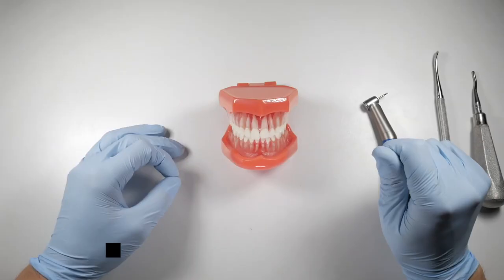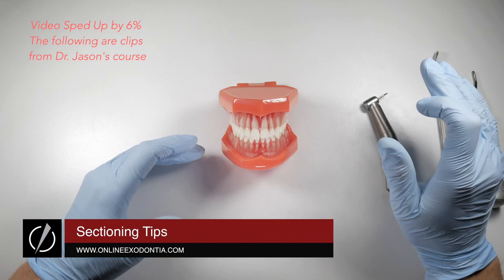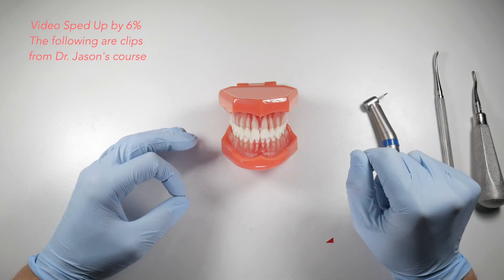In this video I'm going to share his tips on sectioning teeth and his tips on troughing bone. I hope you learn something you may not have known before. Occasionally when we're sectioning teeth and splitting them with an elevator, the crack doesn't always propagate in the direction that we want it to. That's usually our fault because we've sectioned it incorrectly or applied the wrong type of force, but it will happen and you need to be able to deal with it.